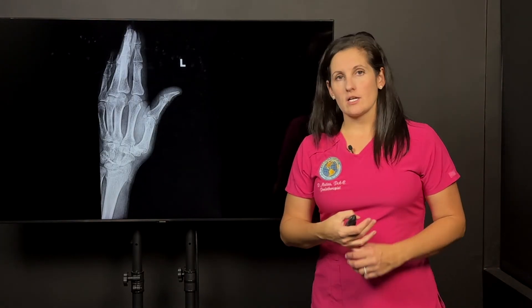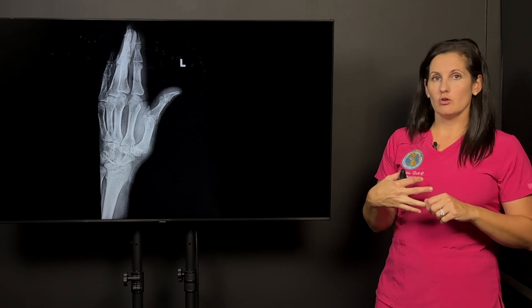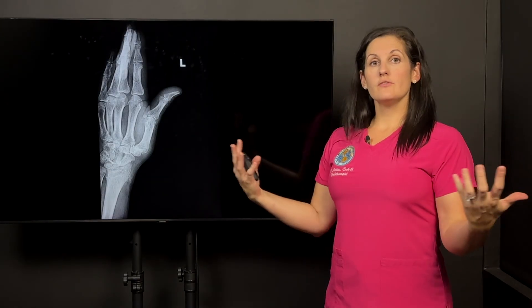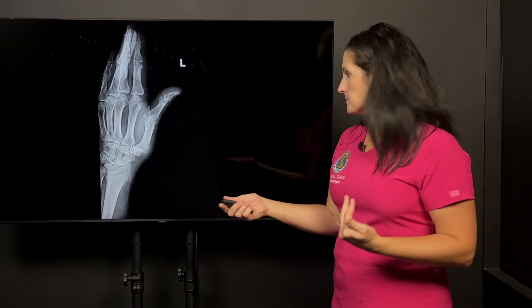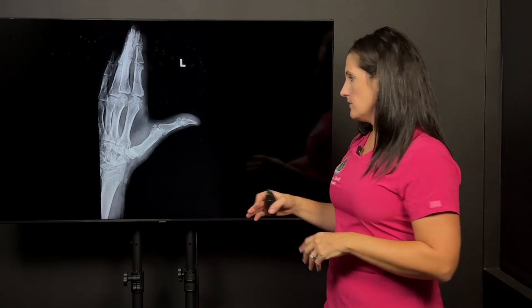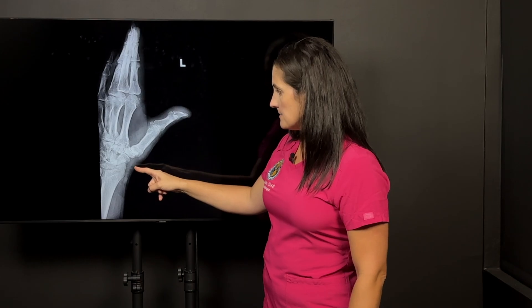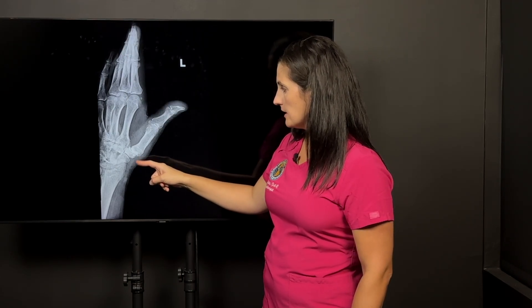We did a motion x-ray of this patient. We call it a DDR, or dynamic digital radiograph — motion x-ray is a little easier to say — where we actually have the patient move the joint under x-ray so we can see what's going on. This is the patient's x-ray, slowed down to about 50% of his normal movement. You can see the CMC joint down here, and you can see it kind of shift a little bit out of place as he's moving it.